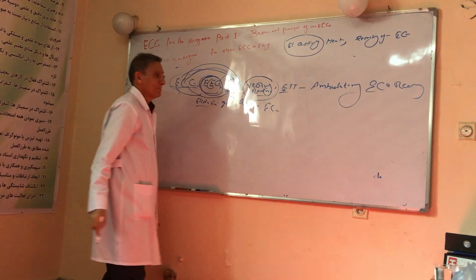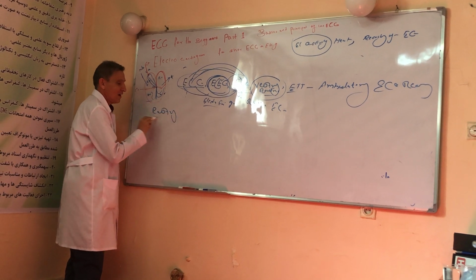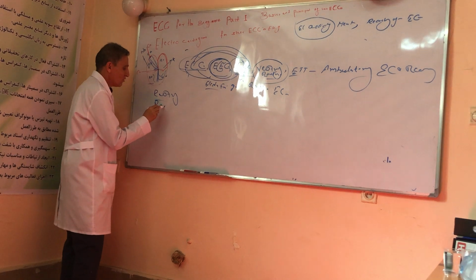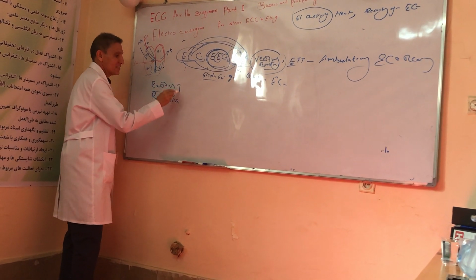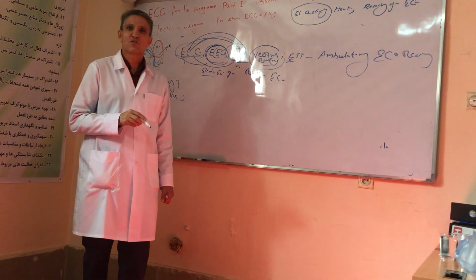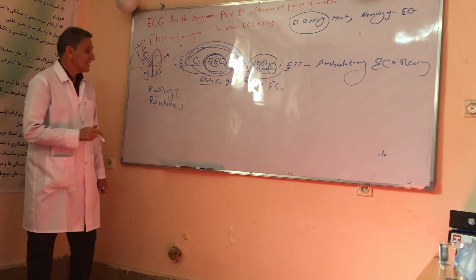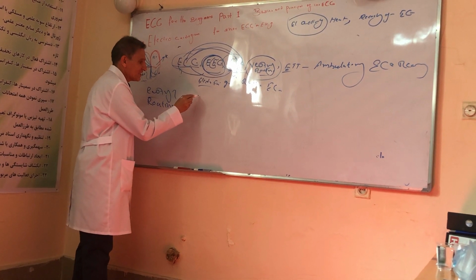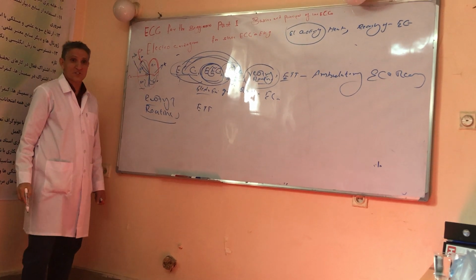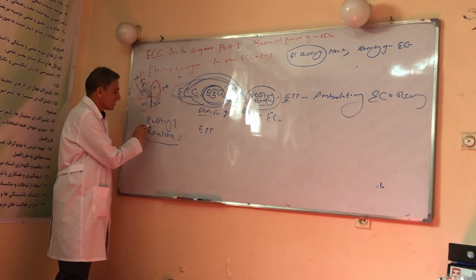Resting ECG. What is resting ECG? I think you are familiar with resting ECG, or routine ECG. Resting ECG is an ECG in which we do not ask the patient to exercise during taking of the ECG. In contrast to ETT, this ECG does not need any special situation or condition, because this is resting ECG.